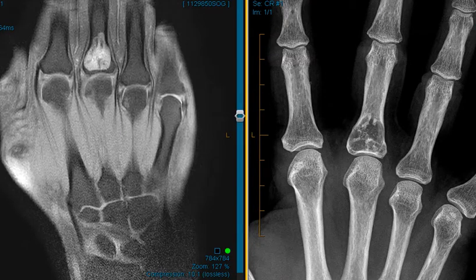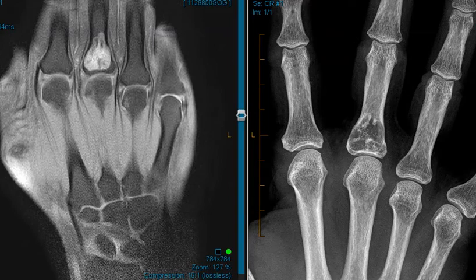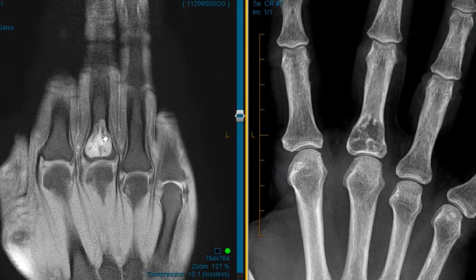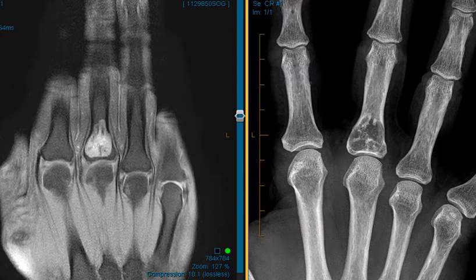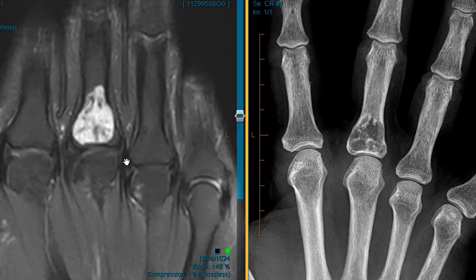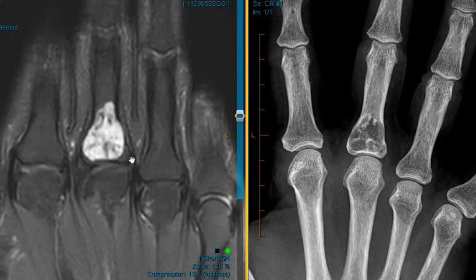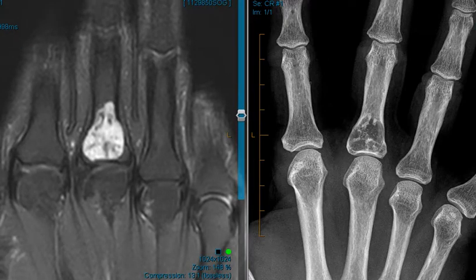This is a T1 view where we've suppressed the fat, so the fat looks dark. We can see the lesion is a little bit bright — brighter than marrow. On the T2-weighted image, the lesion is very bright.